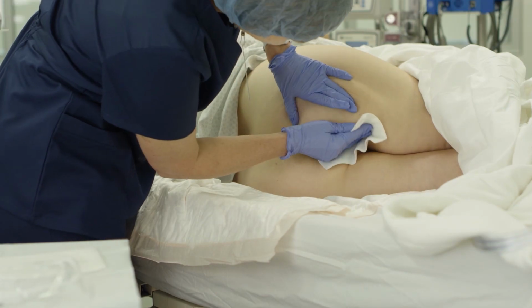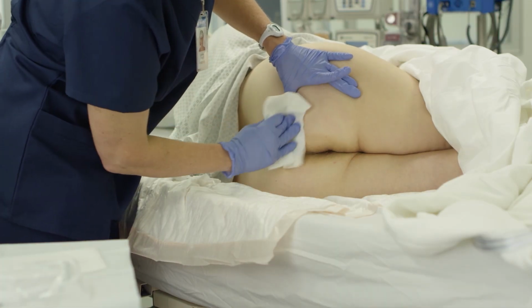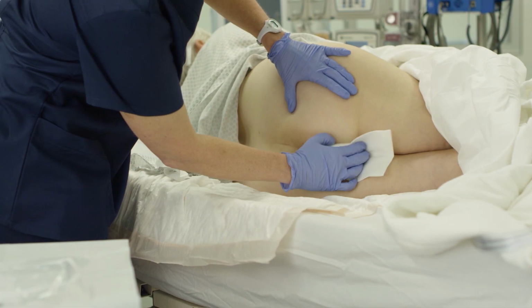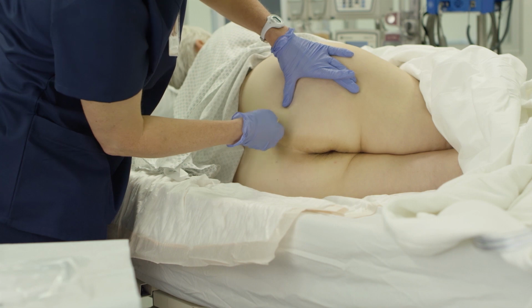Cleanse the skin thoroughly and gently with 3M Cavilon No Rinse Skin Cleanser. If areas of denudement are present, excess serous or serosanguinous drainage may be blotted with a gauze pad if necessary. Make sure you remove all stool from the skin.